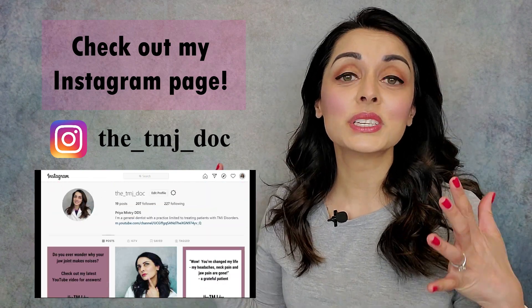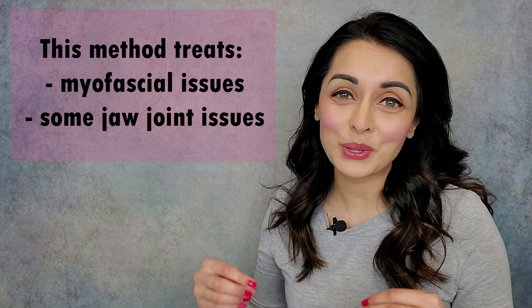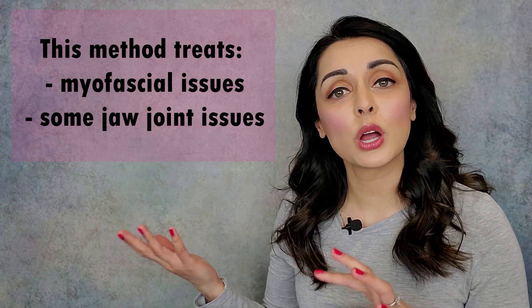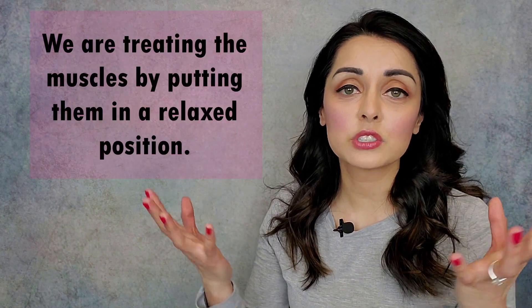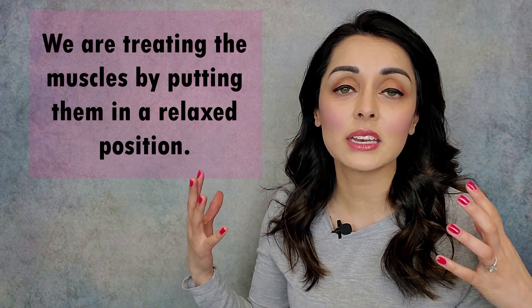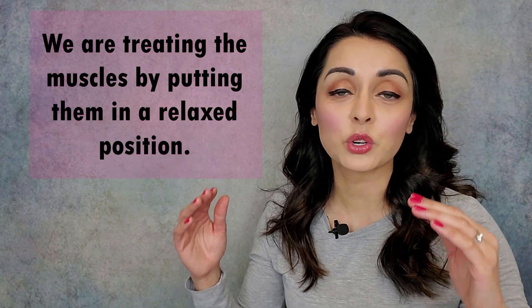With the method I'll be going over in today's video, Dr. Lee has told me that he has seen headaches, jaw joint noises, ear pain, and neck pain all go down drastically with his patients. Typically the headaches, jaw pain, neck pain, and ear pain go down within a month; the jaw joint noises can take longer, three to five months or so. The reason this method works so well for the pain and myofascial concerns is because we are treating the muscles. A lot of that pain is due to dysfunctional muscles of the head, neck, and jaw, and if we're able to put those muscles in their relaxed position, good things tend to happen and we see pain go down quite a bit.